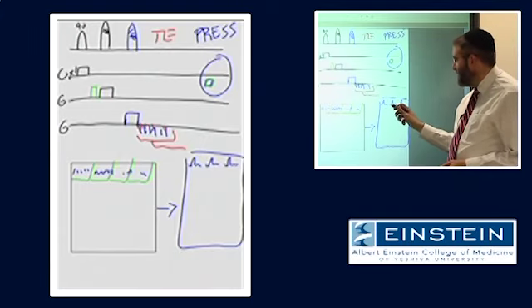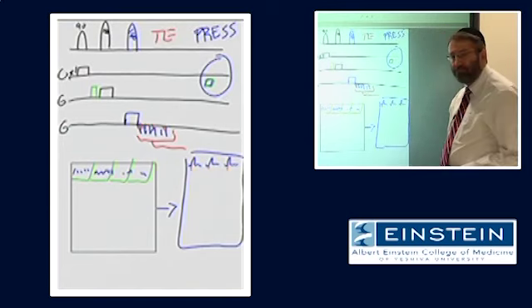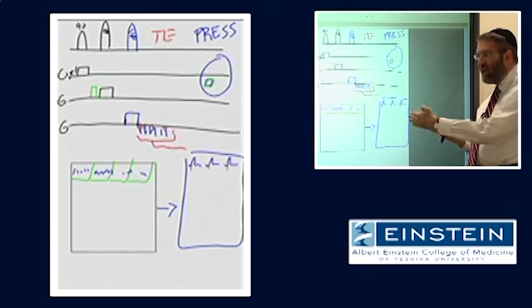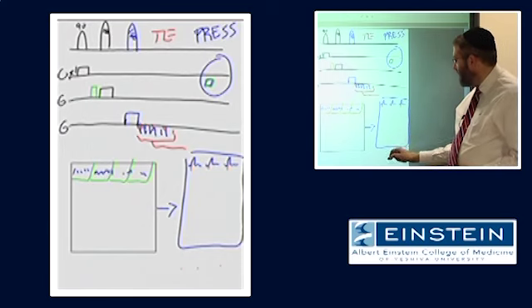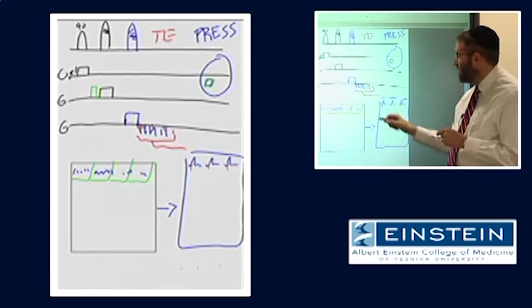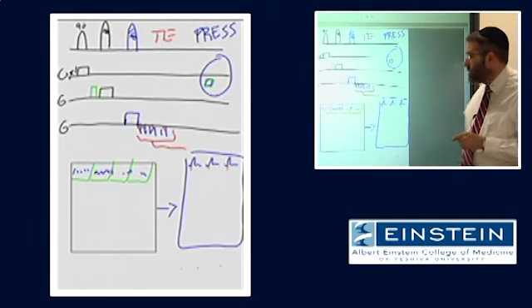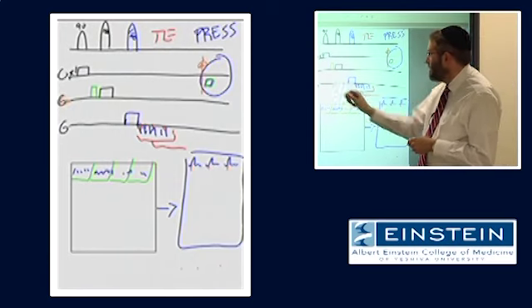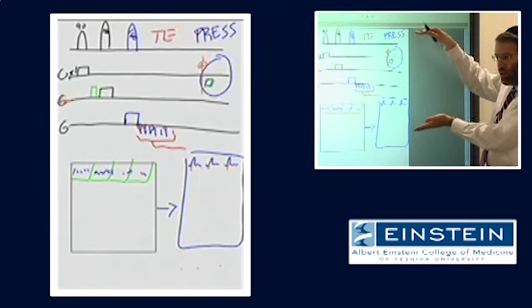Now, if we take each of these spectra and we pick, let's say, the same point in each one, we can do a Fourier transform of those measurements. And that will give us a series of values which tell us, those are specific frequencies in the frequency spectrum. They will tell us the amplitude at that point in the frequency spectrum at different locations along this dimension. So we've now been able to divide, let's say this is the dimension we're talking about. We can tell how much of each spectrum came from each of different locations along that dimension of the voxel.